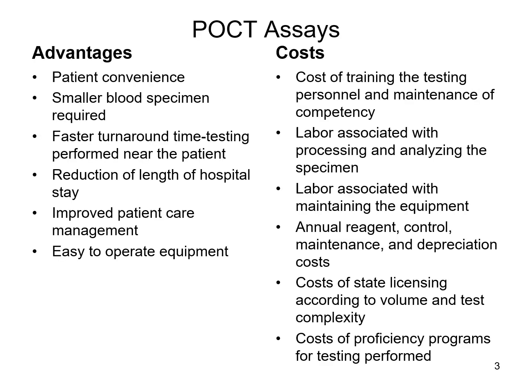There are some advantages to point of care testing, which can include convenience to the patient. Most of the time with point of care testing, most testing can be done off samples like a finger stick or urine samples, feces. So those are pretty easy to collect. It's not as invasive for the patient. And they do have a faster turnaround time because it is being performed at the patient, and you don't have to wait for that sample to go to the lab and get results back.